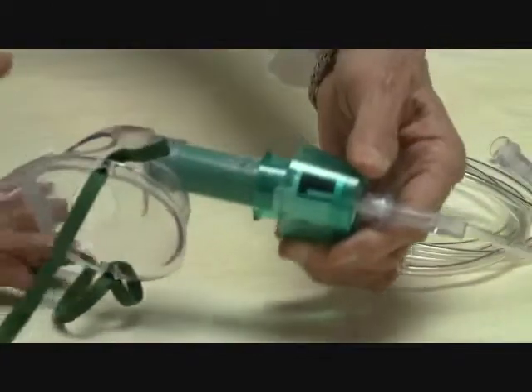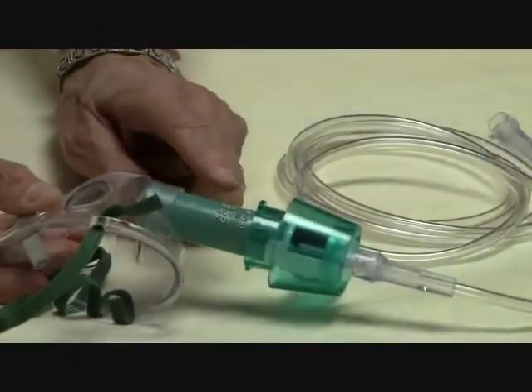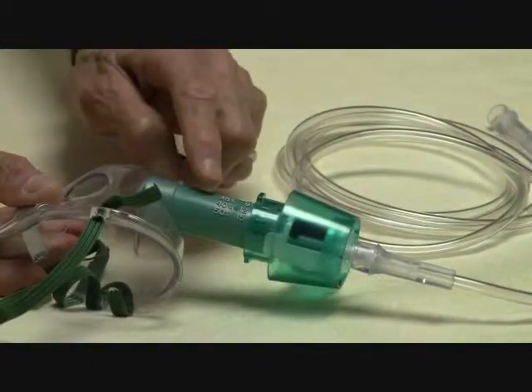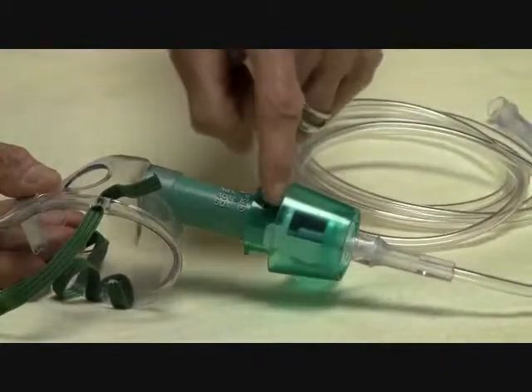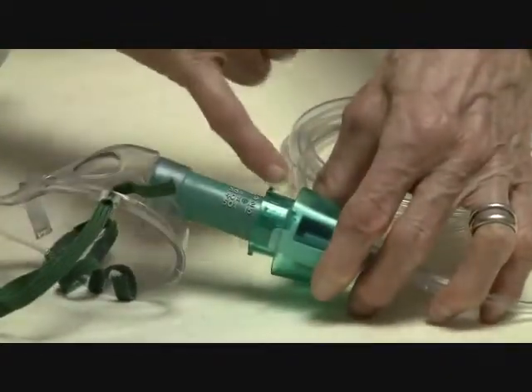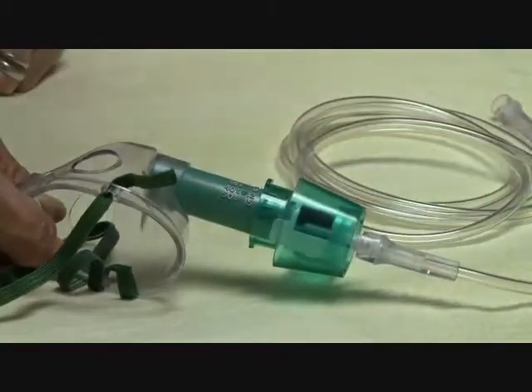So what you're going to do is on your device, you will locate the appropriate percentage of FiO2 and you will dial in. There's an arrow here that you will use to dial in to get to the 35%.